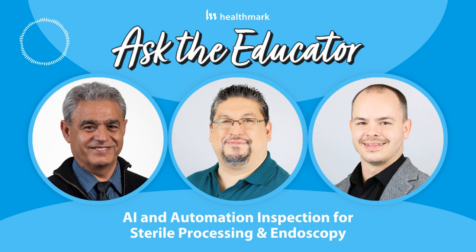So when we talk about monitoring the process, which all of these address, how do you do that? We need to look at whether the device is being cleaned. For example, AAMI ST91 is the one that really dives into this and is one of the best practices for endoscope reprocessing.